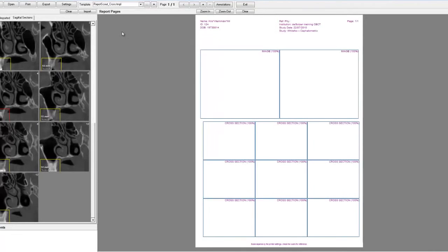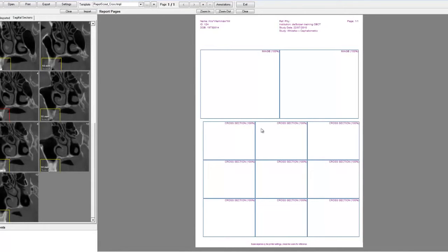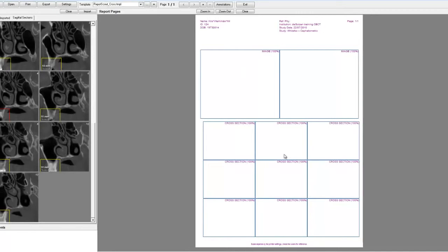In general, what we do is when we install you the White Fox, we take some time to work with you in seeing exactly what are the ones that you are going to be using and what are the ones that you are not. So once you are selected, and in fact this one is a quite good one, you can simply extract your images by simply drag and drop.